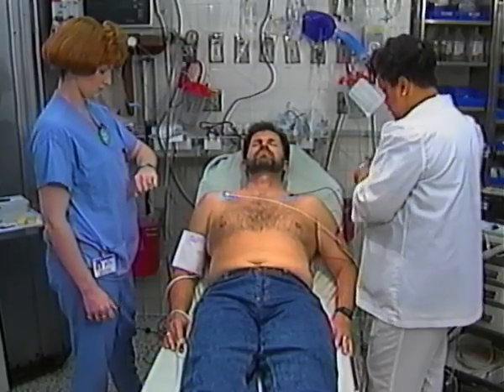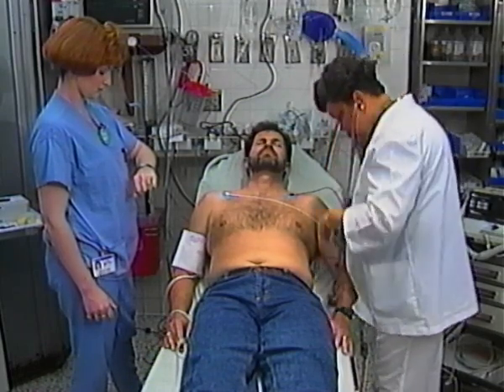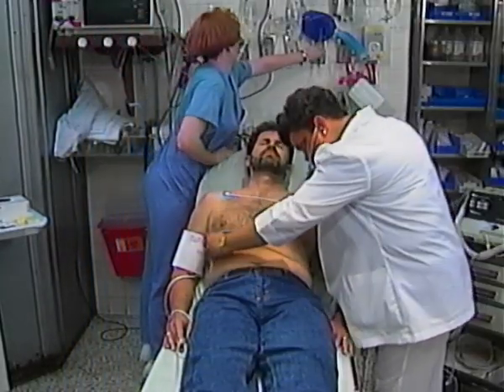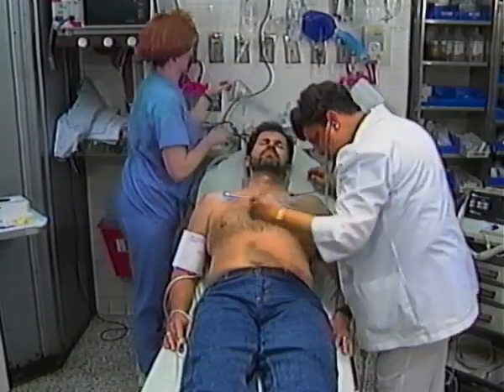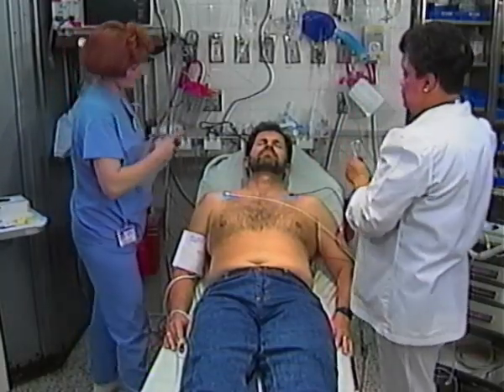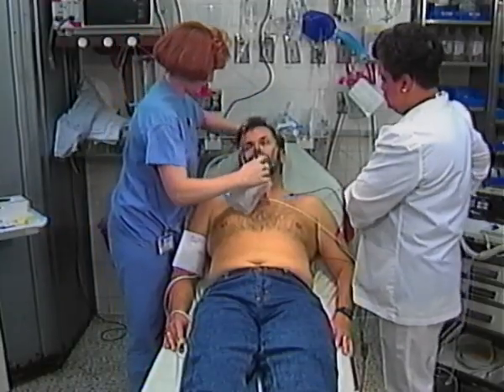Mr. Jackson, I'm going to listen to your lung sounds. I want you to breathe normally for me. I'm putting some oxygen on your face. This mask might get a little uncomfortable, but try to bear with it.